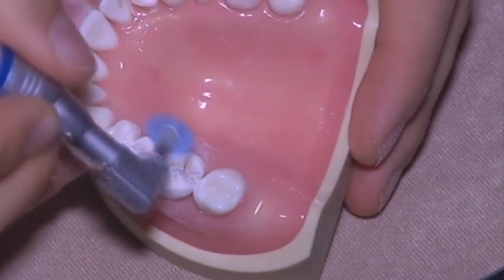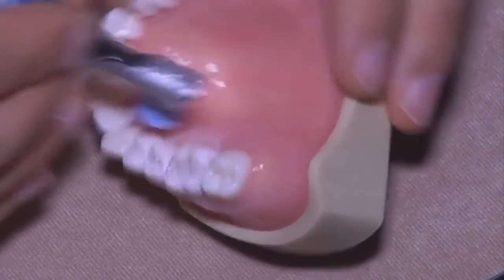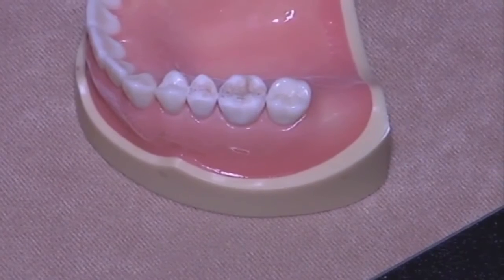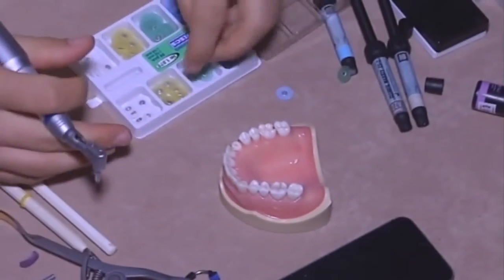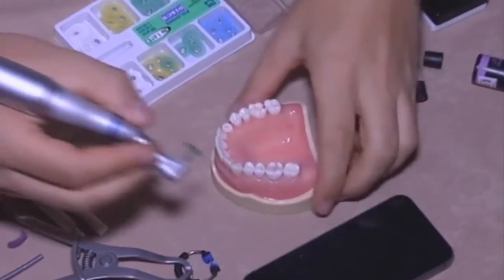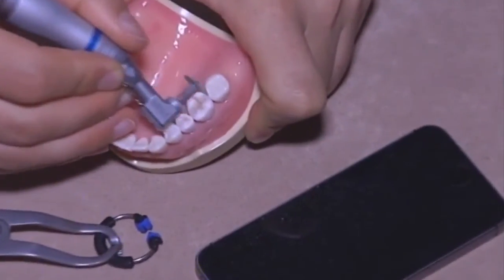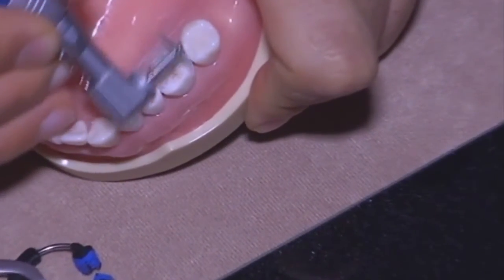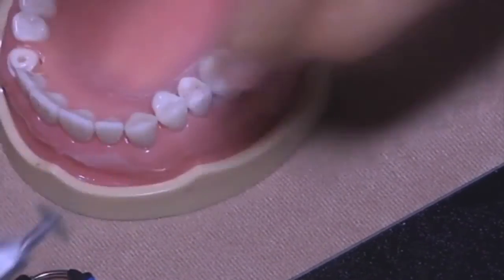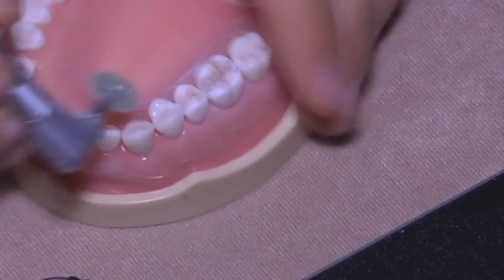Then blow, and you can just decrease the grain size of your disc in order to have also a polishing effect.